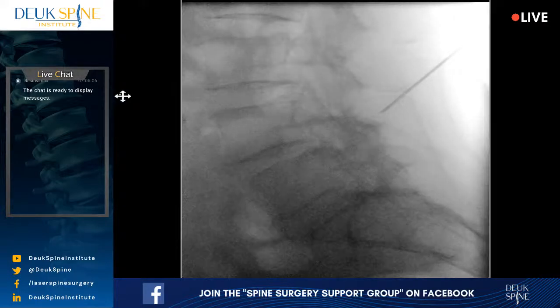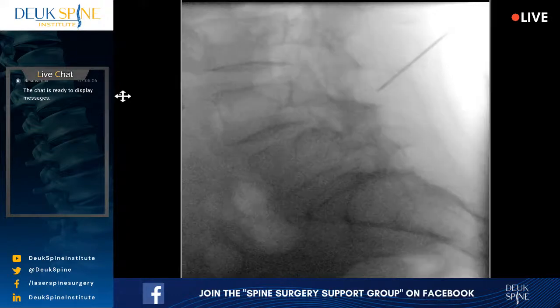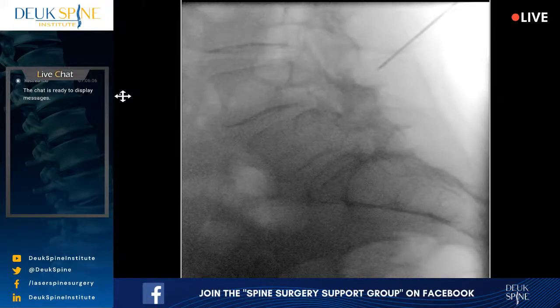And before I go any further, I really want to get the spine lined up. Now, the spine is a three-dimensional structure. You're going to need to wag a little bit, I think. The spine is a three-dimensional structure sitting kind of in the middle of the body almost, just a little bit posterior towards the skin in the back. But what I have to do here is line the bones up properly so that we're getting a true lateral. I don't think that's a true lateral. I know the pedicle looks pretty good, but it looks like the end plate of 5 at the bottom, inferior end plate of 5, is not lined up. Yeah, keep working on it.